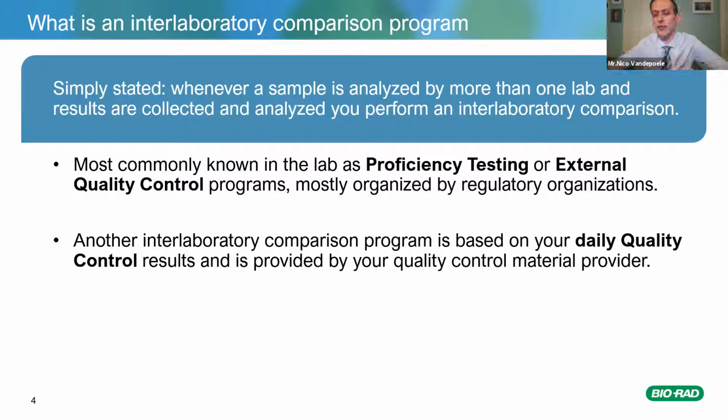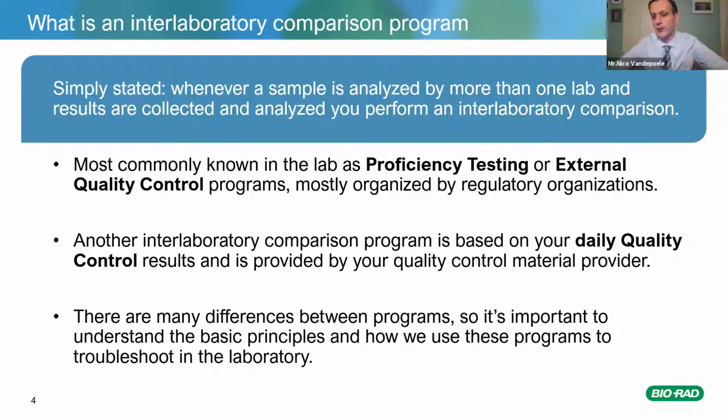I'm going to try to show you what the differences are and what some of the advantages or disadvantages could be of the two programs, and how you can also troubleshoot with them. It is important to understand that there are many differences between all these proficiency test programs, and there are international standards and guidelines. But what I am talking about here might not always be exactly the same as your program in your lab, because it could be offered by a different company or a different provider. So it is always important to understand the principles of the program, and then you can understand why some of that troubleshooting might be going in one direction, or why we might be looking at other things for another program. This is what I'm trying to help you with today.